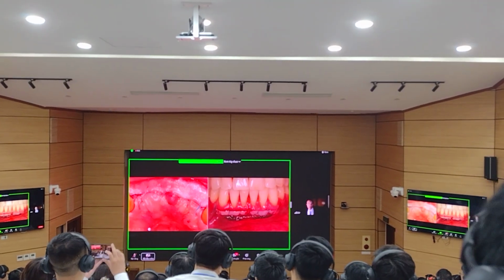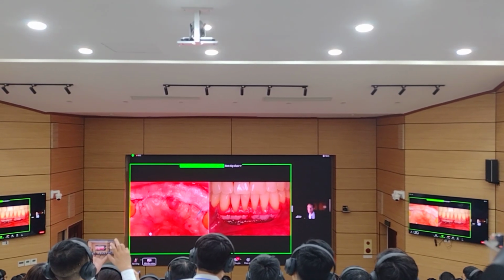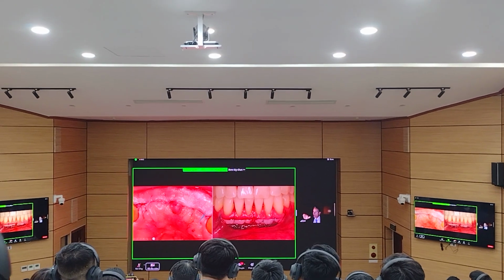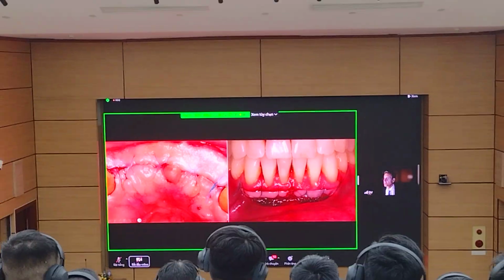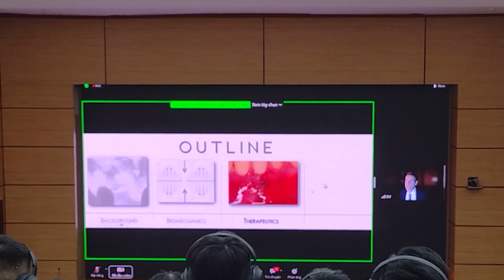So again, we can use these loops. I'm very fond of the loops. I like loops because loops are going to act like pulleys. They're going to reduce forces and tension, and they are going to also distribute those forces much more equally in order for us to achieve the results that we would like to achieve.